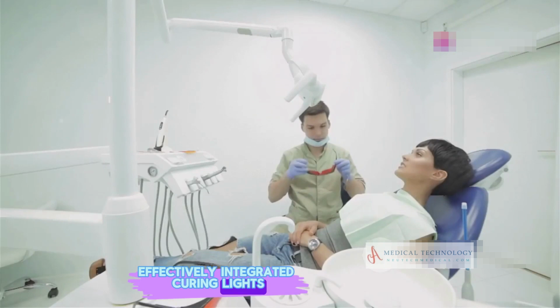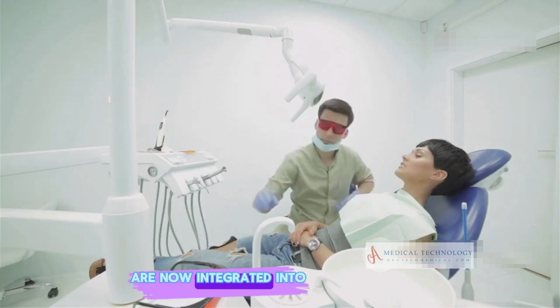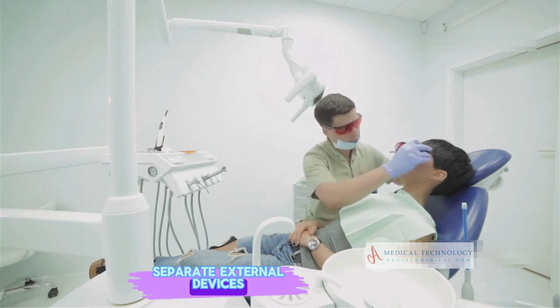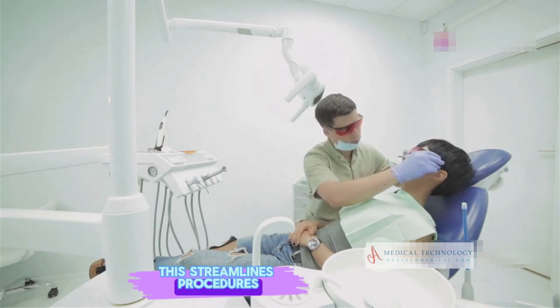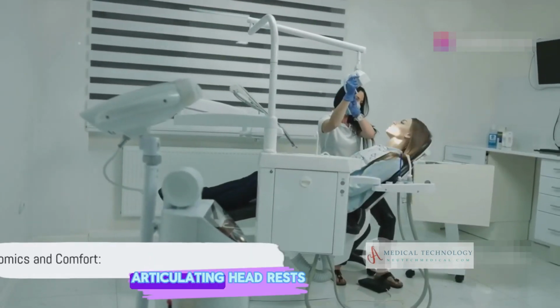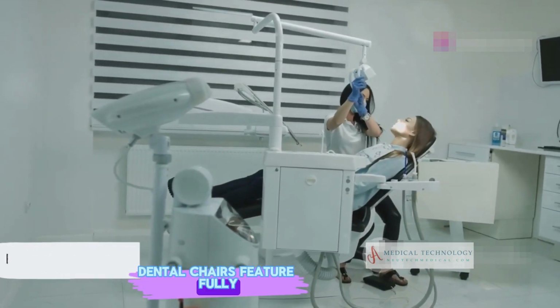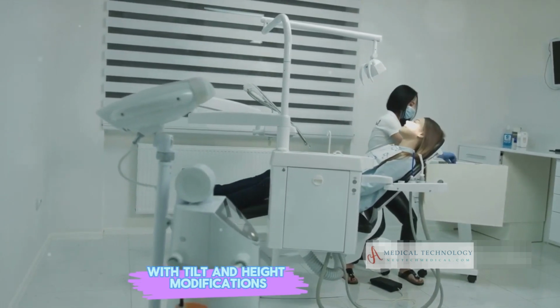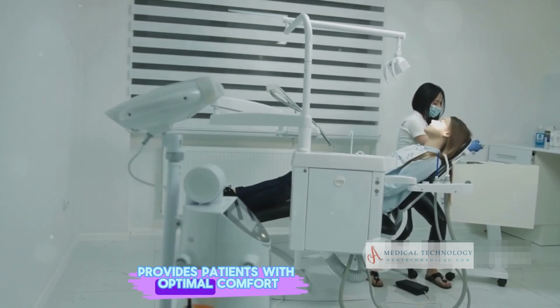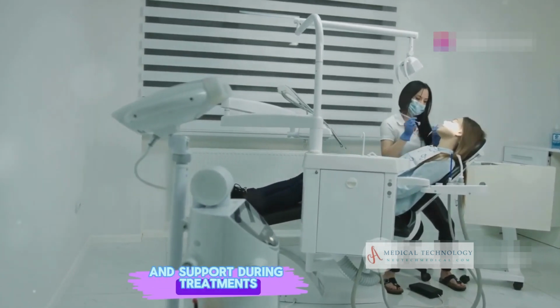Integrated curing lights. LED curing lights are now integrated into the dental chair itself, eliminating the need for separate external devices. This streamlines procedures and ensures efficient curing of dental materials. Articulating headrests. Dental chairs feature fully adjustable headrests with tilt and height modifications. This customization provides patients with optimal comfort and support during treatments.